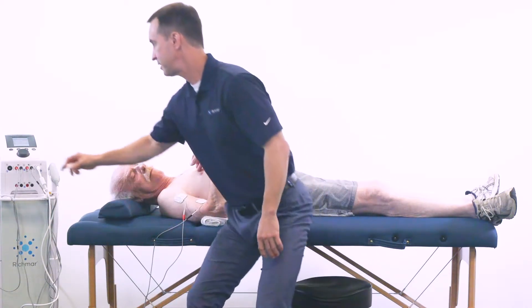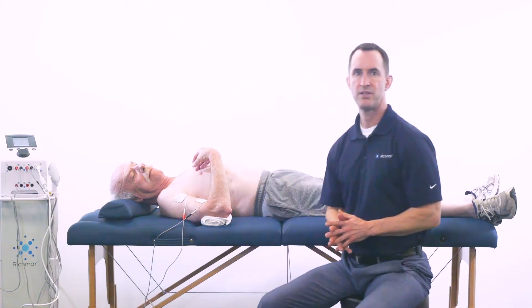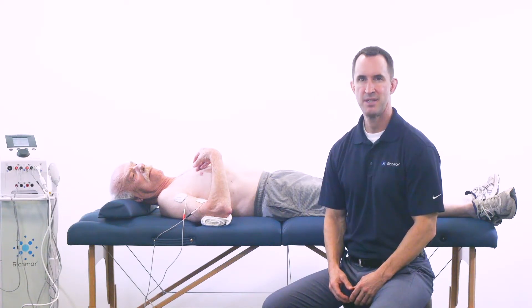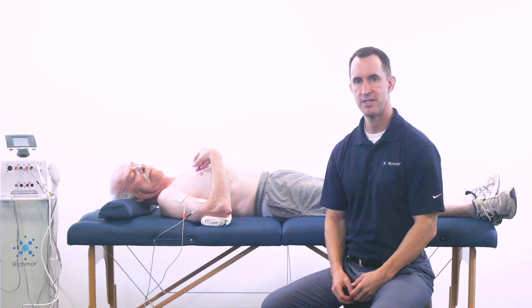I'm going to turn the treatment off and stop the treatment. A clinical consideration: once the patient begins to experience a reduction in hypertonicity in the biceps, you want to encourage activation of the triceps in therapeutic exercise and functional tasks to promote improved elbow extension. What we just did was more of a passive range of motion, but you could start to incorporate more functional activities while using this electrotherapy protocol.